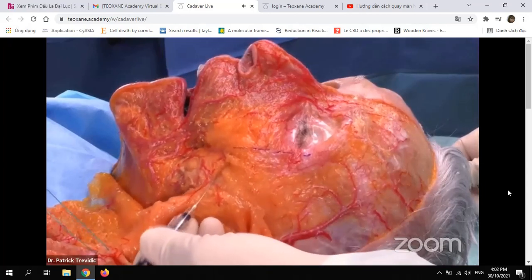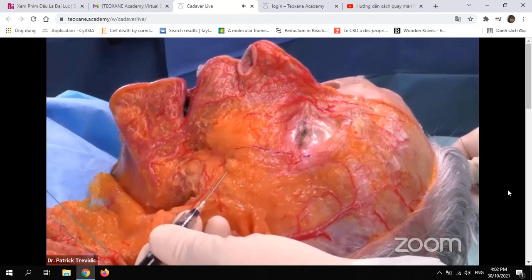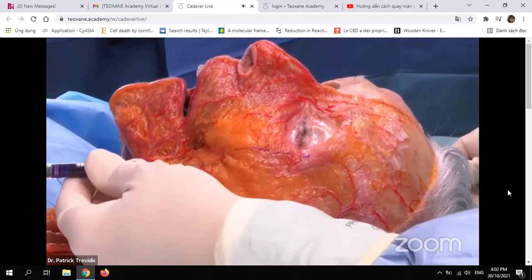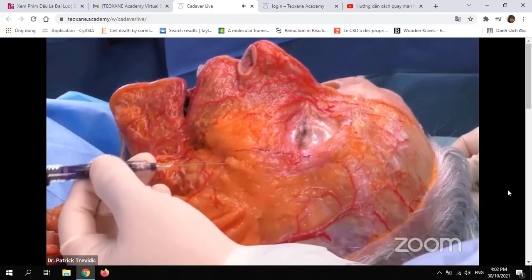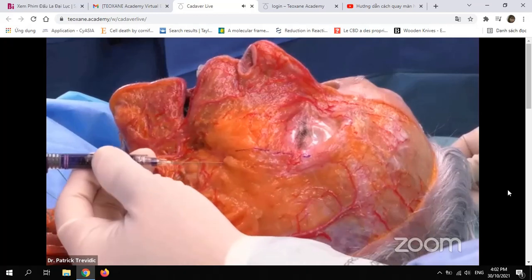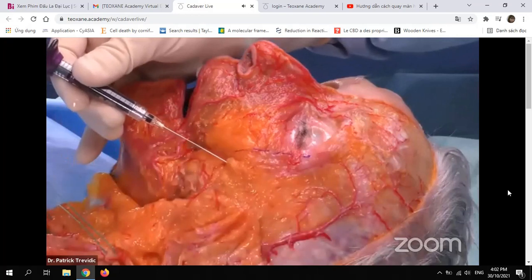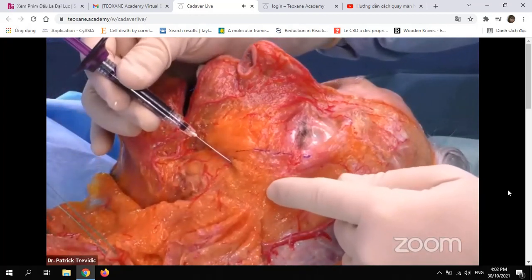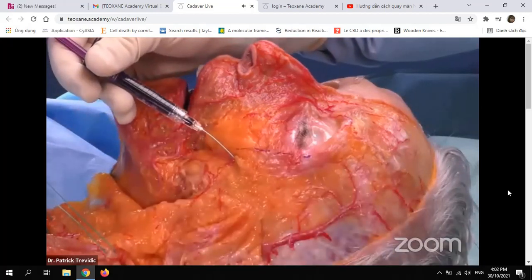So the second injection of Nabila was going deep on the bone, sliding on the bone, going up until she reached, here, as you can see, the medial SOOF. Then she moved laterally to the lateral SOOF, up again. As you can see here, my cannula is in the lateral SOOF. Going, if you want, to the zygoma, and going also deep here. The tip of my cannula is here. If I inject, you will see where is the deep injection.